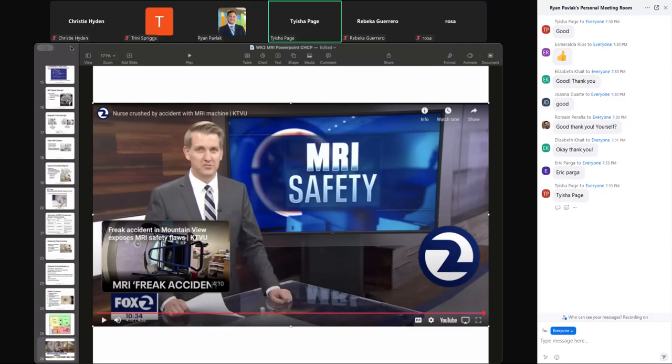That's crazy. So even if you're walking in a hallway and you've got some kind of magnet on or whatever, you could be drawn towards this MRI machine? No barriers? Yeah, so each of the MRI units are going to have what are called the 5 Gauss lines. So that's within the MRI room.